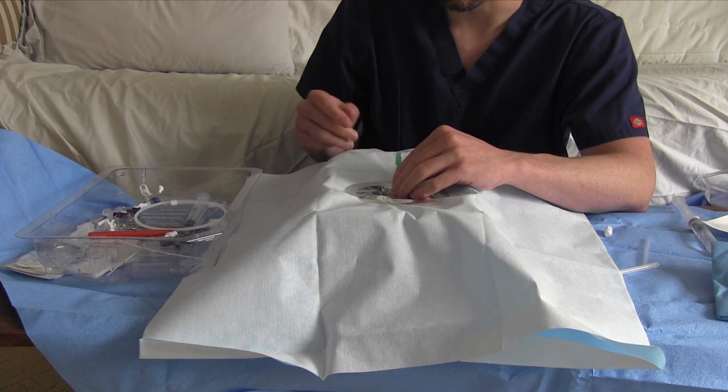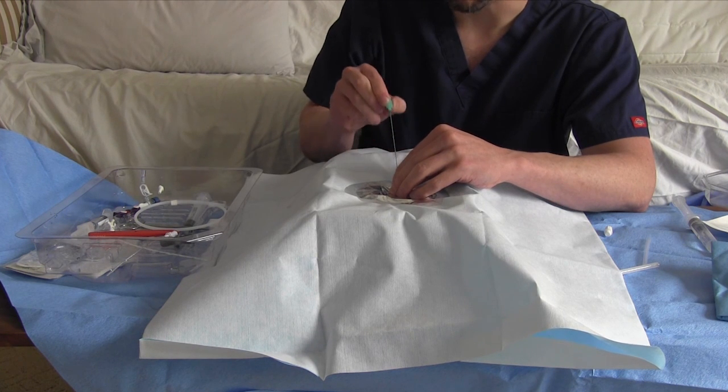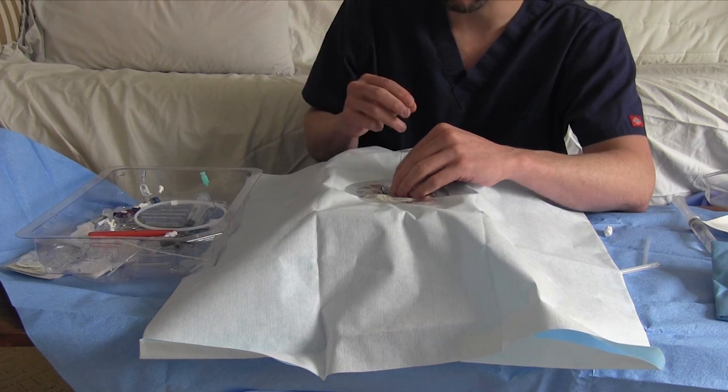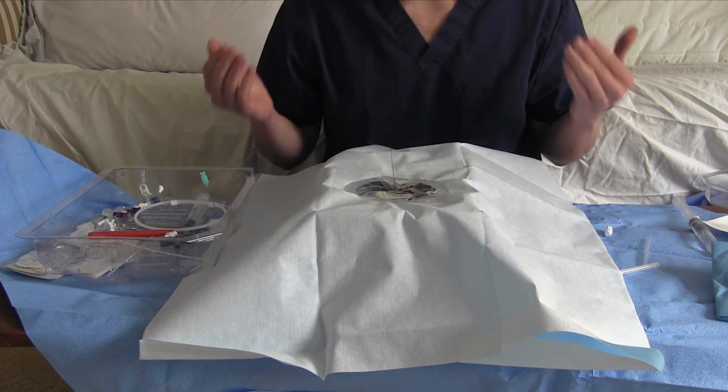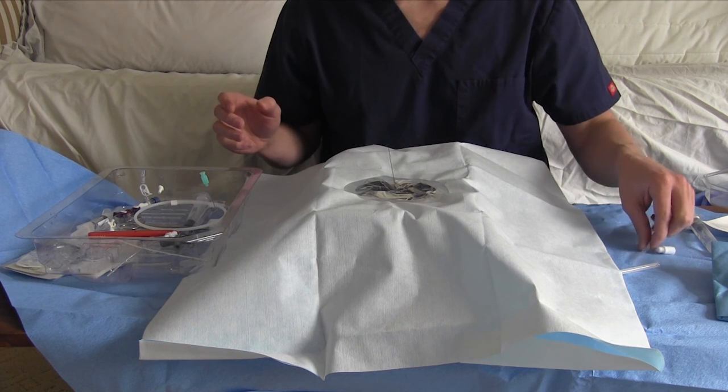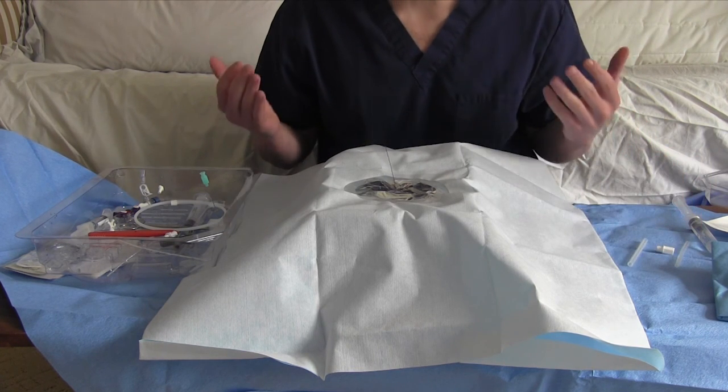All right, so now I have a wire in the vessel. I can take my needle out and pop it into the nice little integrated sharps container. Now, here is the point where we don't have a clear, easy answer to what you need to do next, and maybe the PICC nurses will help us out, but you need to release your tourniquet.